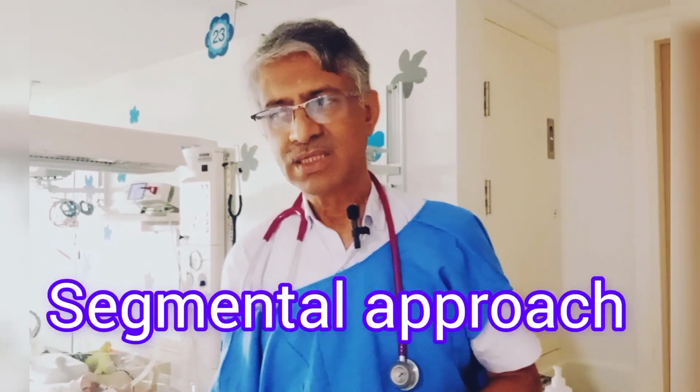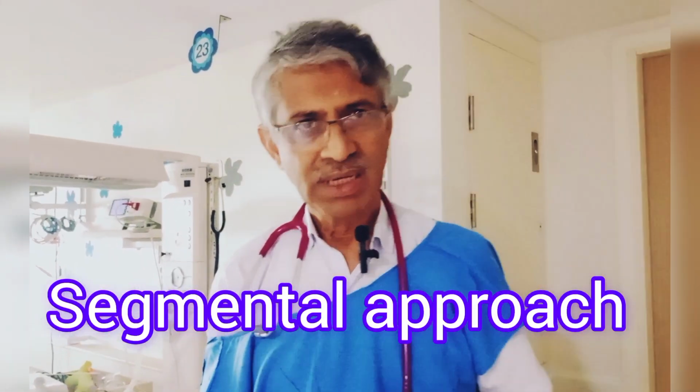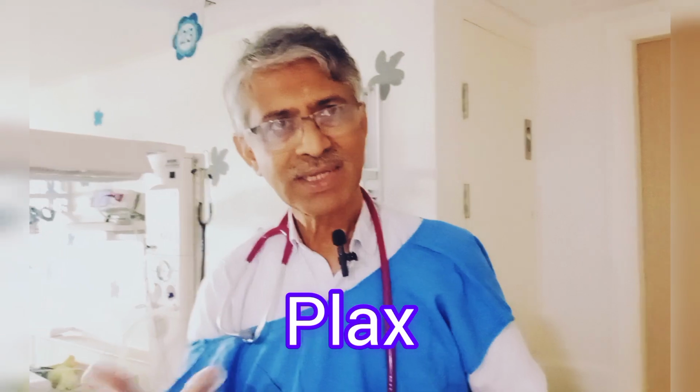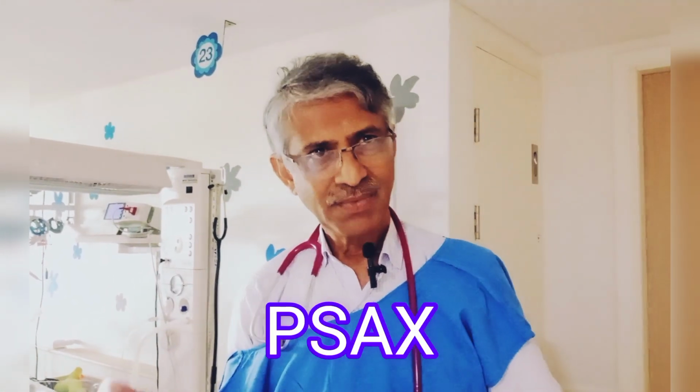So any neonate, if you suspect cyanotic heart disease, kindly do the segmental approach and get normal anatomy in your mind and see to that is there any abnormality. So 3 important views one should know is parasternal long axis, where left ventricle opens into the pulmonary artery and you can see 2 branches. The other one is parasternal short axis, where the aorta will become anterior to the pulmonary artery. You can see that pulmonary artery branching into 2 and aorta going straight. So that is on parasternal short axis.